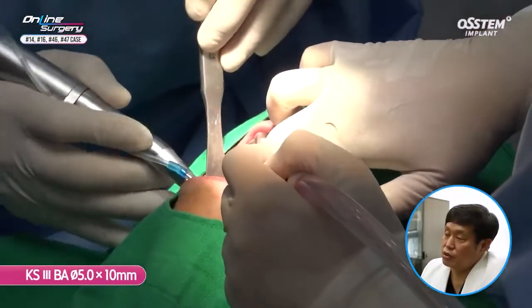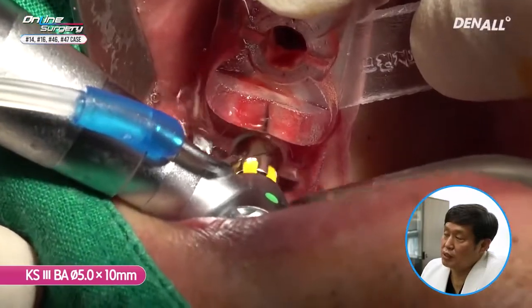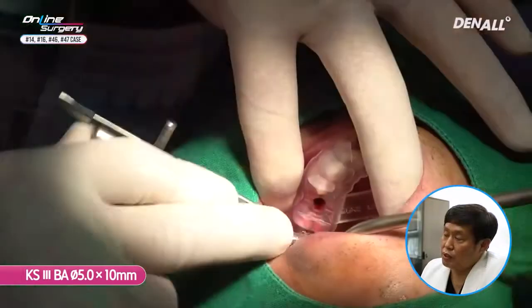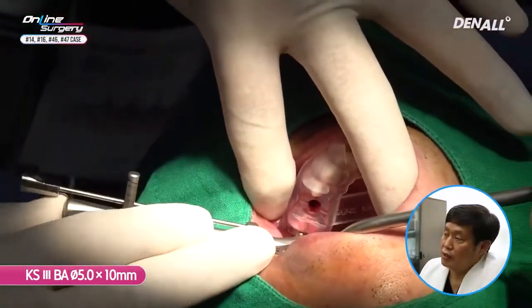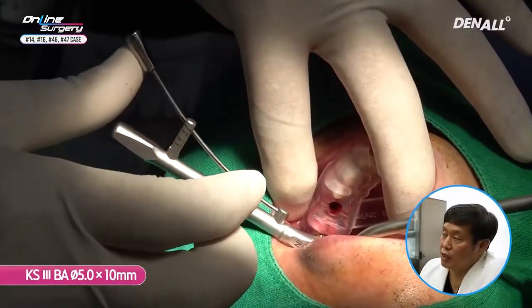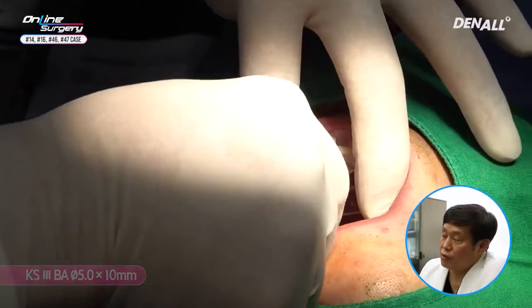KS3BA 5.0 by 10 millimeter implant is used. It is irrigated with saline water. I'm placing it approximately 80% with engine. Hand wrench is used to get the final position. In number 16, primary stability is satisfactory.